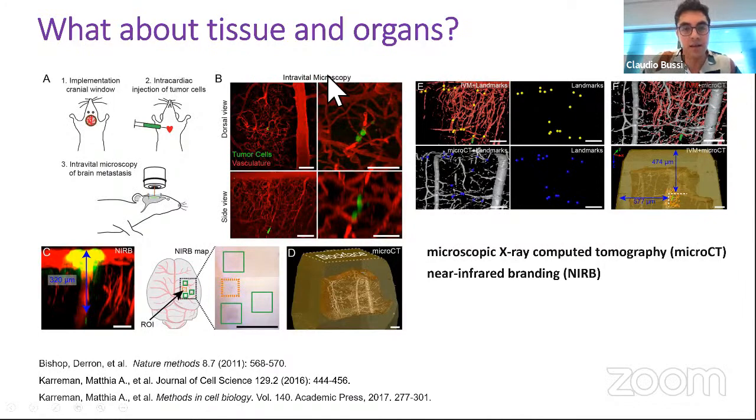Entonces, por microscopía intravital van a poder realizar adquisición de imágenes de la vasculatura con microscopía de 2 fotones, y las células tumorales expresan GFP, entonces las podemos seguir simplemente haciendo el tracking de la fluorescencia verde.